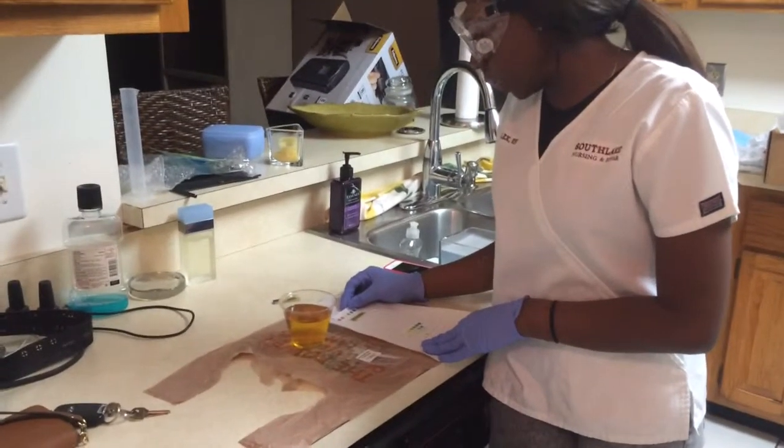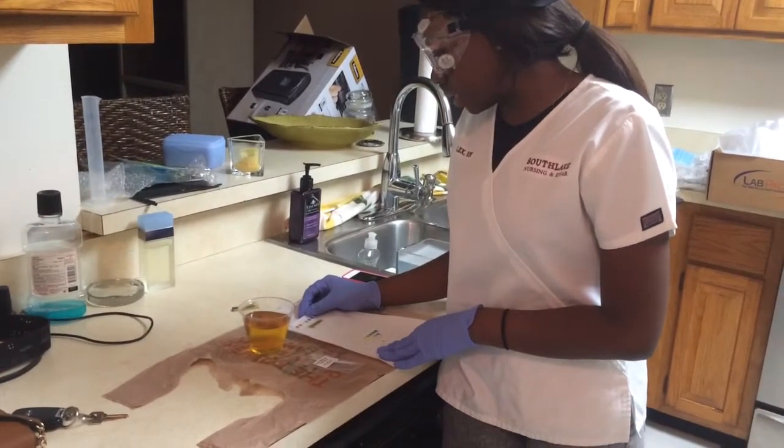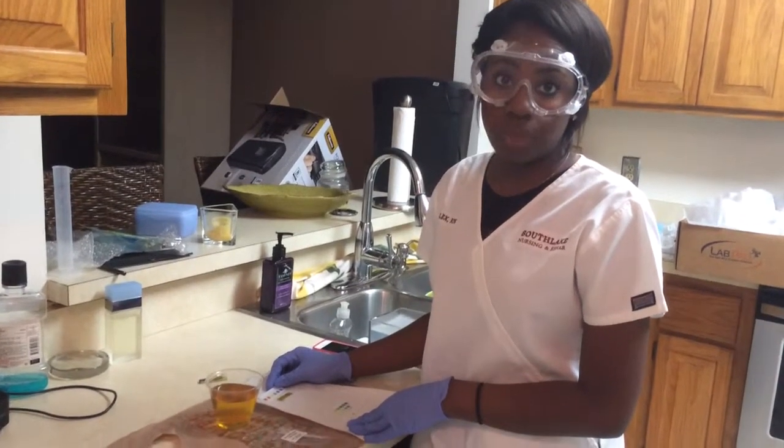As it's showing, the pH of my urine is probably between a seven or eight. The normal pH of urine is four point six to eight.